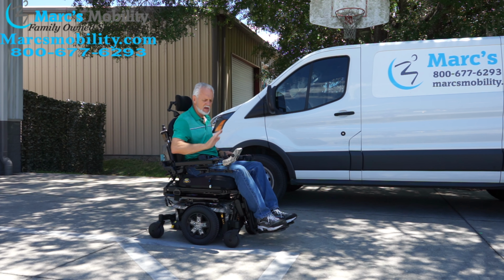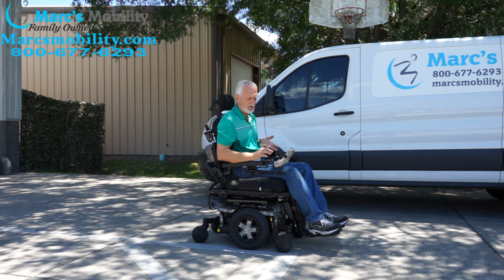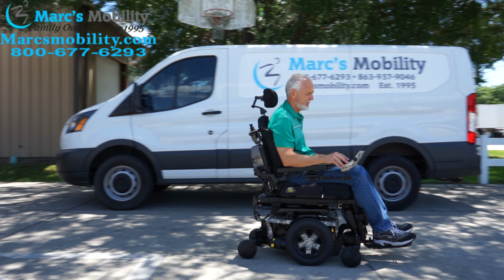So you can control the speed like a gas pedal in your car by just moving the joystick a little bit forward like this, and you're barely moving. Or you can use the 5 speeds on here and bring them down to speed number 1. I drive it on fast just for time's sake.